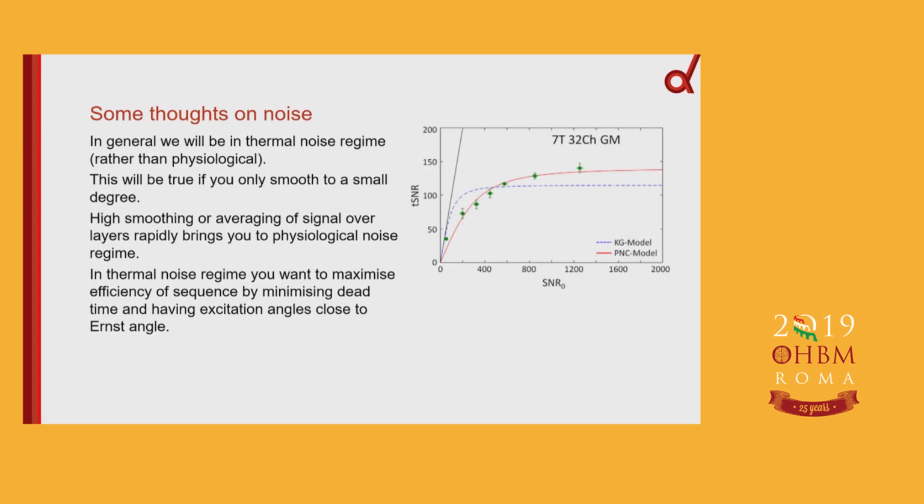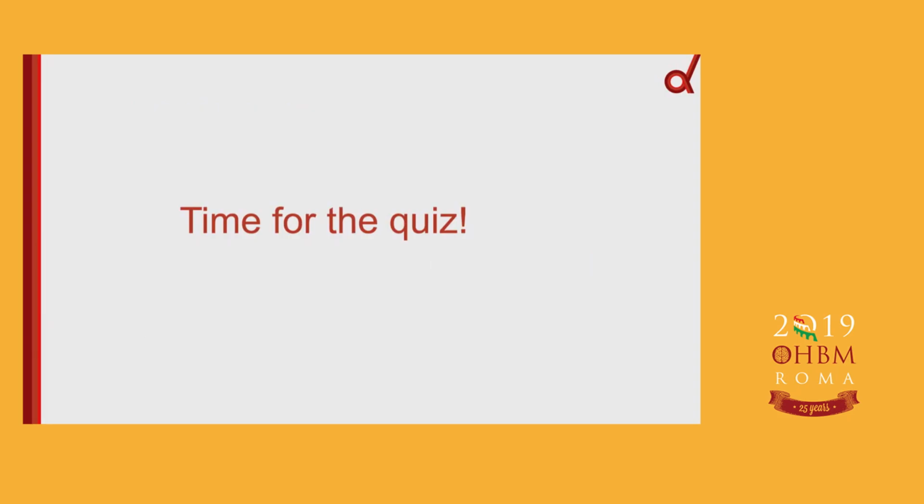Maximize the efficiency of your sequence by minimizing the dead time and having excitation angles close to the Ernst angle. With that, Wietske will now release the quiz questions.